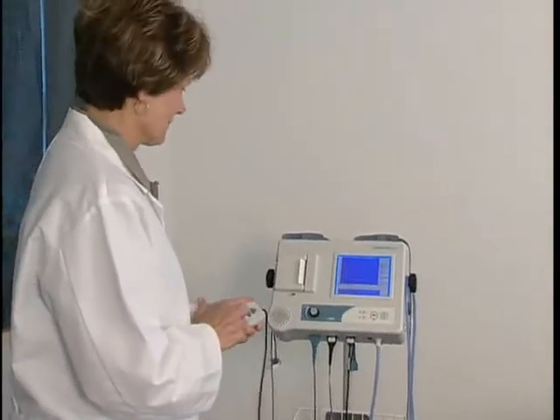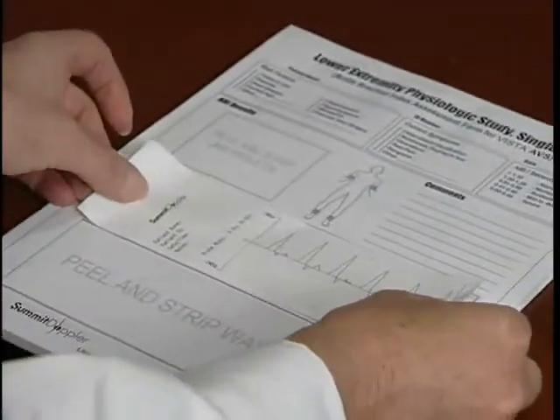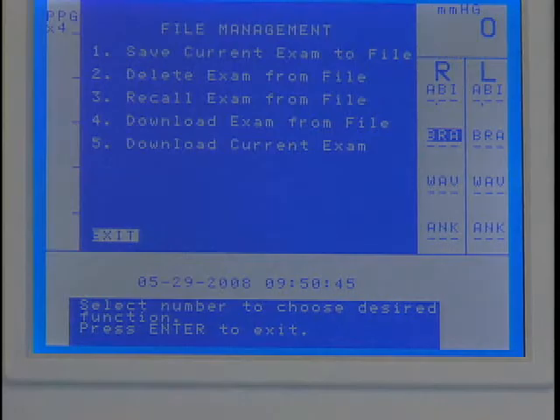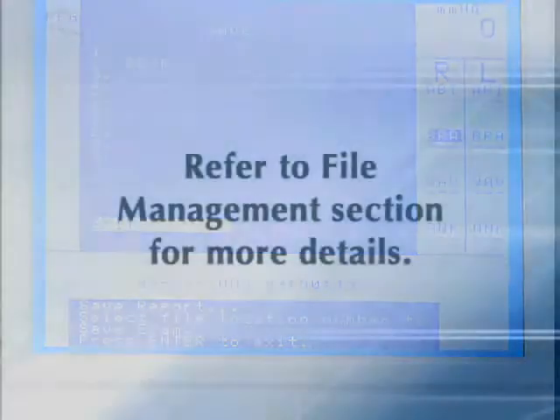After completing the exam, press PRINT and apply the adhesive-backed labels with the exam results onto the report form. Or save the exam to one of the 10 storage locations as explained in the file management section of this video.